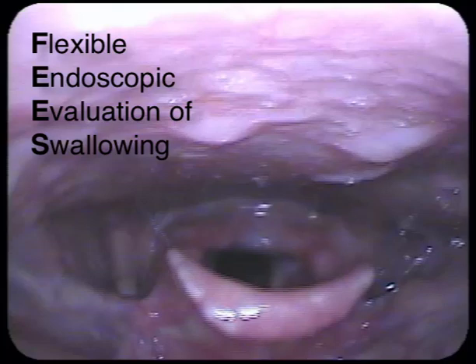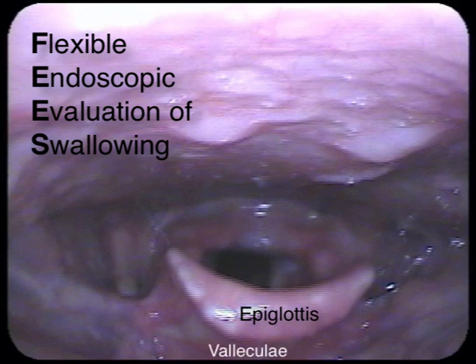Here we see a fees image. Below the base of the tongue and behind the epiglottis we have the vallecula. On either side of the larynx we see the pyriform sinus cavities. If we look into the larynx we see the open glottis and the airway.